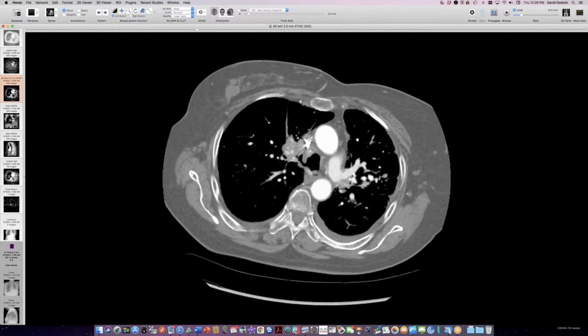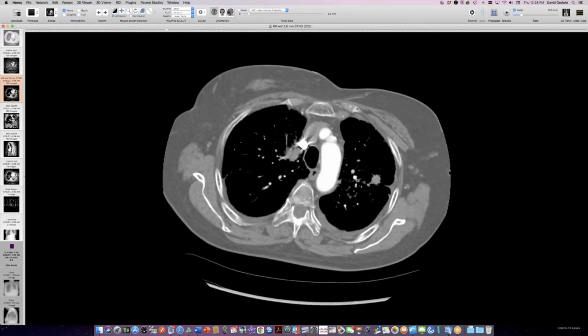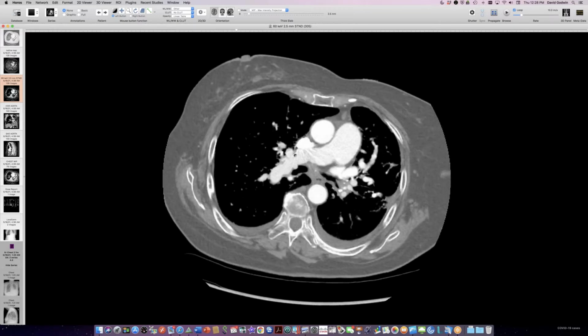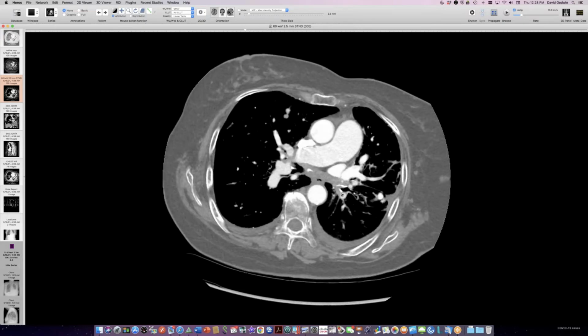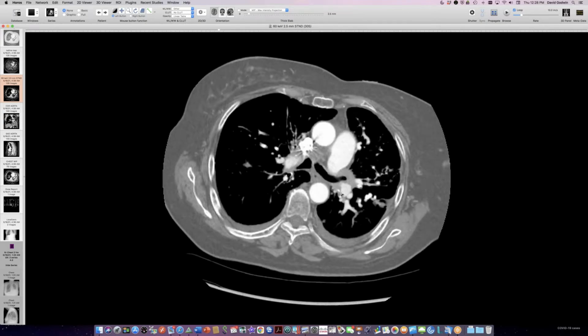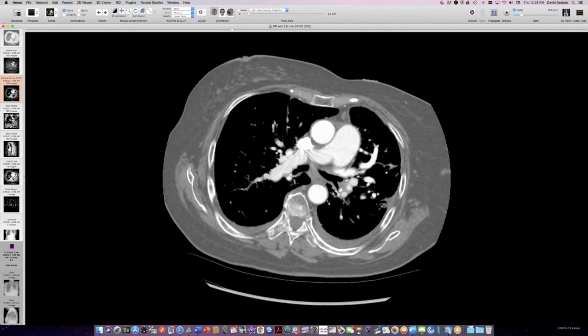So there's all this mediastinal and hilar mass going on here. I don't have a non-contrast CT to show you, but there is some calcification. These are not just vessels that we're seeing in this. And I think, again, there's calcification here. I would like to look at a non-contrast just to make sure that, given how bright this is, I don't think that this is contrast, but this person would be entitled to have some collateral pathways opening up. And we got this irregular pulmonary artery here.